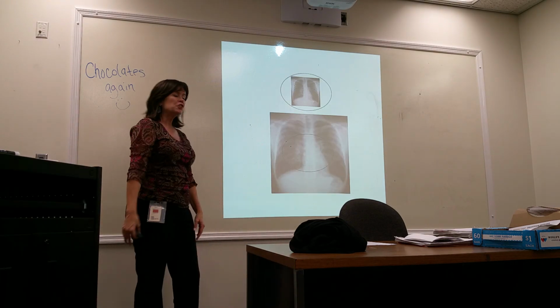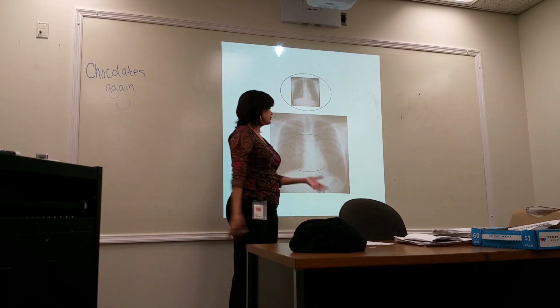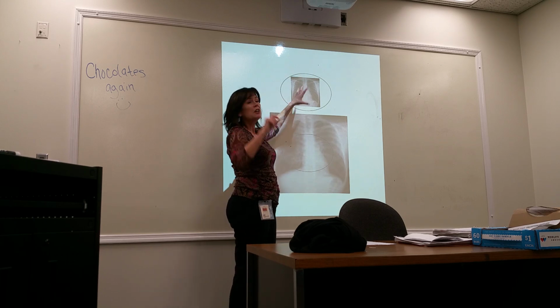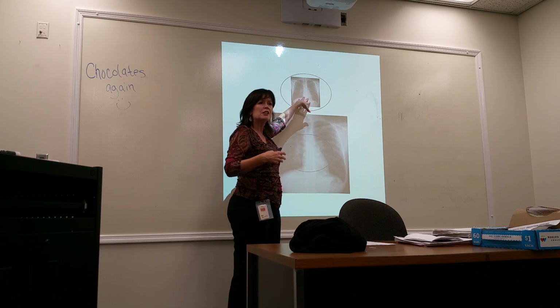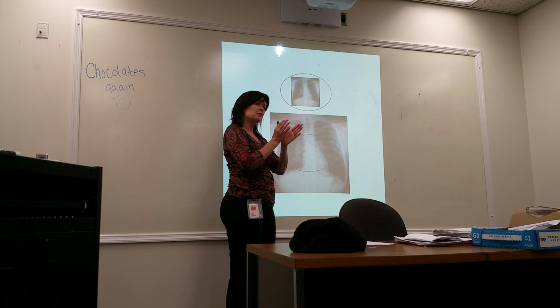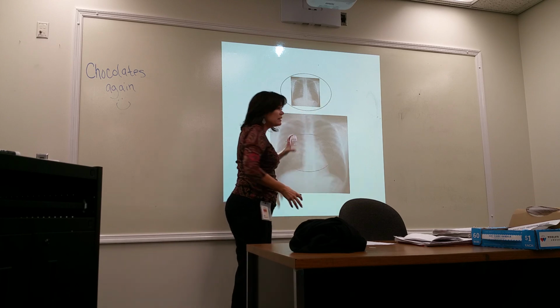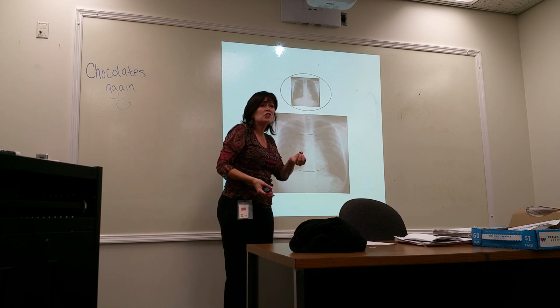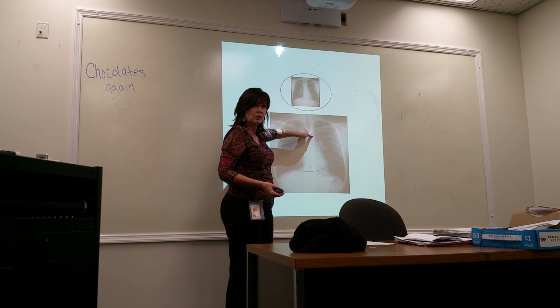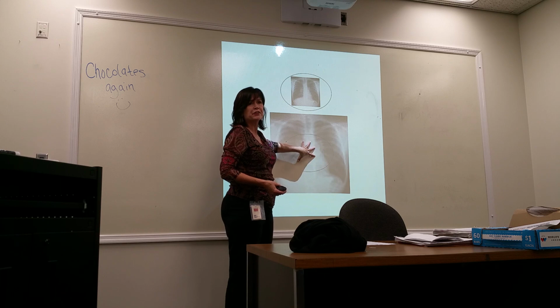Okay, and so this is a picture I've shown you before. You actually have this PowerPoint in a longer version from last year. So this is what you're seeing. I just put a picture of a chest x-ray. So you're doing a fluoro of a chest, you see the whole chest. When you go into the mag mode, the electrons cross sooner, the beam is bigger, right? But the output phosphor size doesn't change. It's still the same size. This circle here is the same size as this circle. So you're only capturing what is hitting on this output phosphor.